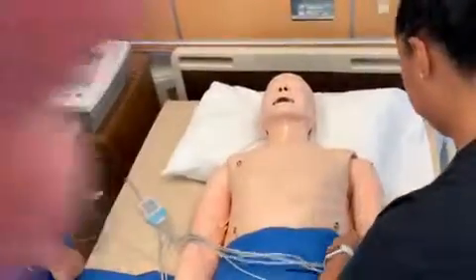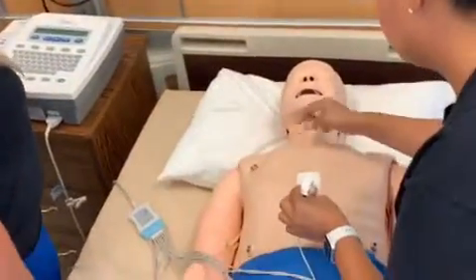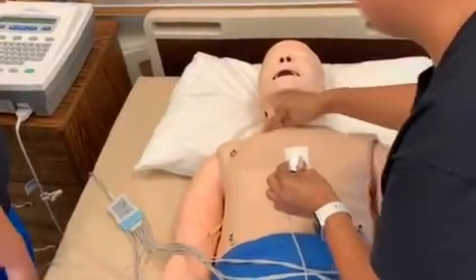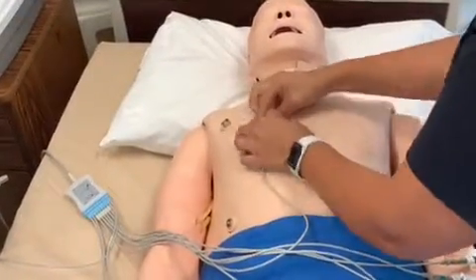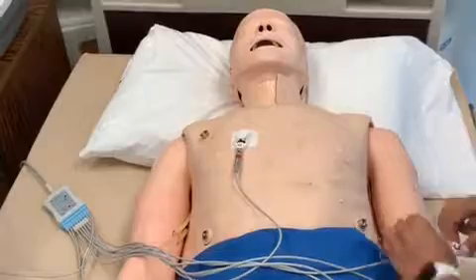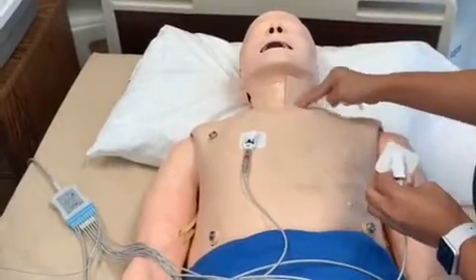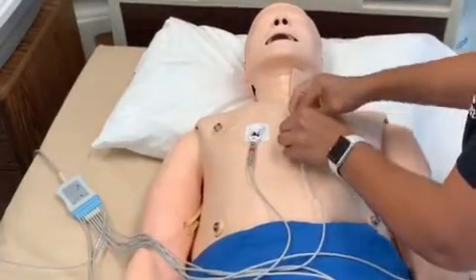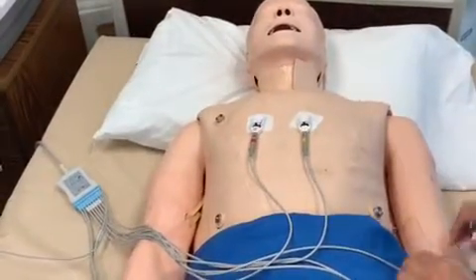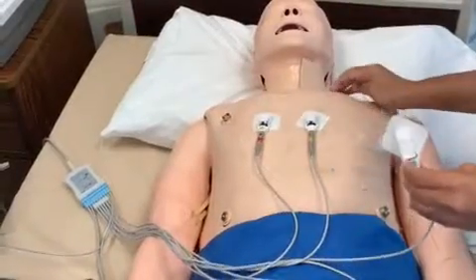V1 is going to go on the fourth intercostal space on the right sternal border. 1, 2, 3, 4. V2 is going to go on the fourth intercostal space on the left sternal border. 1, 2, 3, 4. V3 goes directly between leads 2 and 4.